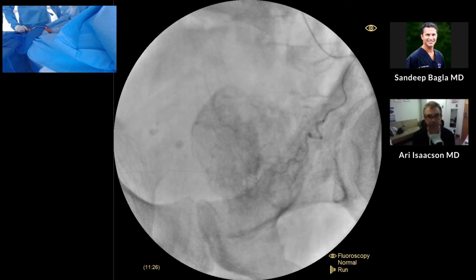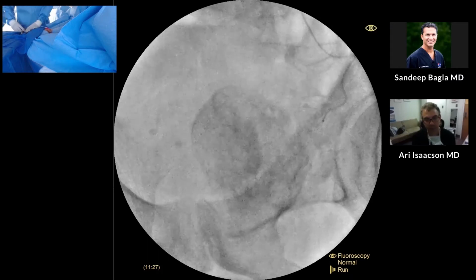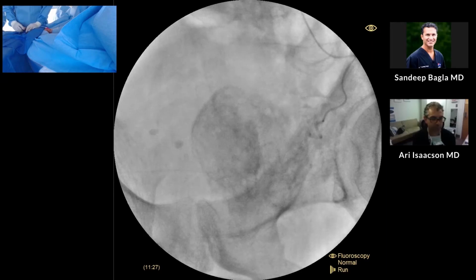Yeah. So for myself, I was using predominantly an 018 GT wire. Now I can still use the same wire in this 2.0 catheter, which is nice. And then the other wire, the one I used during this case, for example, was an Asahi Meister wire, and that works very well in terms of its radio opacity. The other wire I tend to use a lot, which is not so much a problem from Boston Scientific in terms of its size because it's 014, is the Transcend wire. So the Transcend really hasn't changed. That could be used, obviously, as you know, in any of these, just like the Fathom.